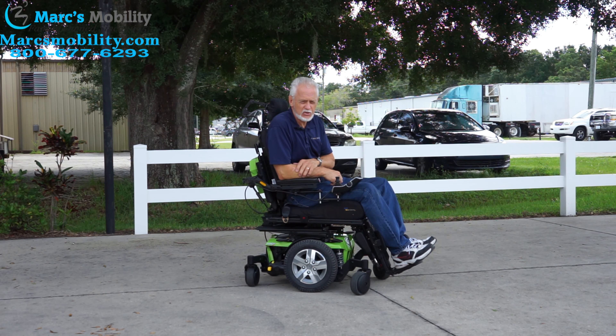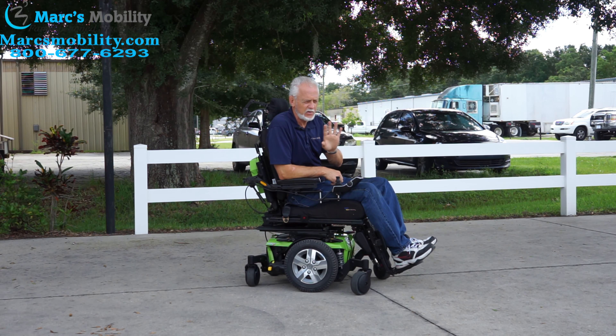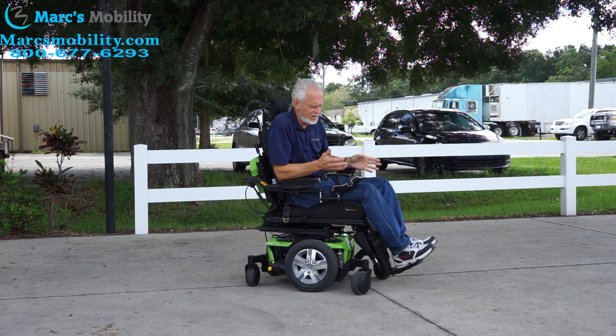So if you're looking for a nice power chair with a lot of comfort — with tilt, recline, and electric legs — that has two miles, this is a good one.